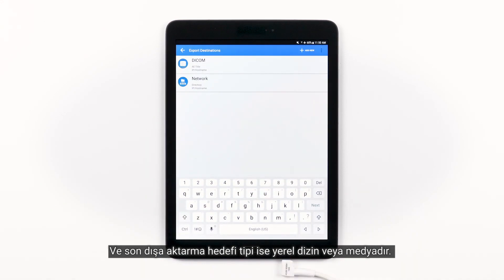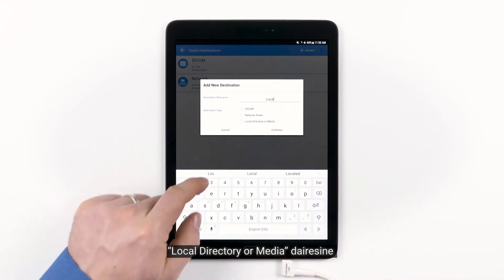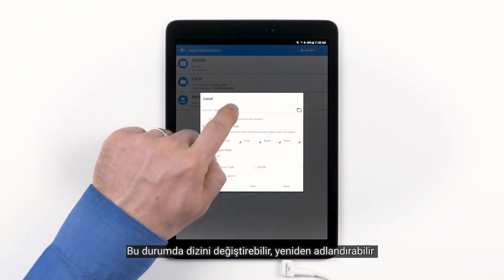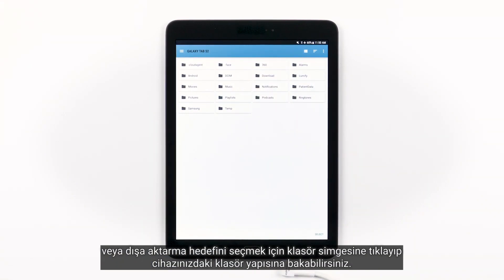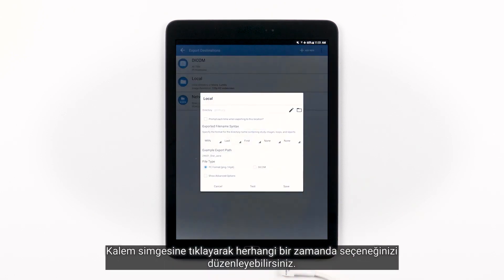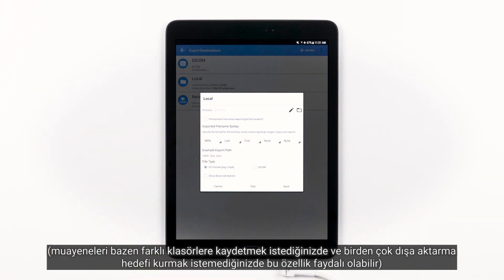The last export destination type is local directory or media. We're going to name it Local. Tap the circle for local directory or media and then tap Continue. You can change the directory, rename it, or tap the folder icon and browse the folder structure on your device to choose the export destination. When you find the right folder, tap Select. You can edit your choice anytime by tapping the pencil icon. You also have the option to be prompted each time you export to this location, which may be helpful if you want to save exams to different folders without setting up multiple local export destinations.